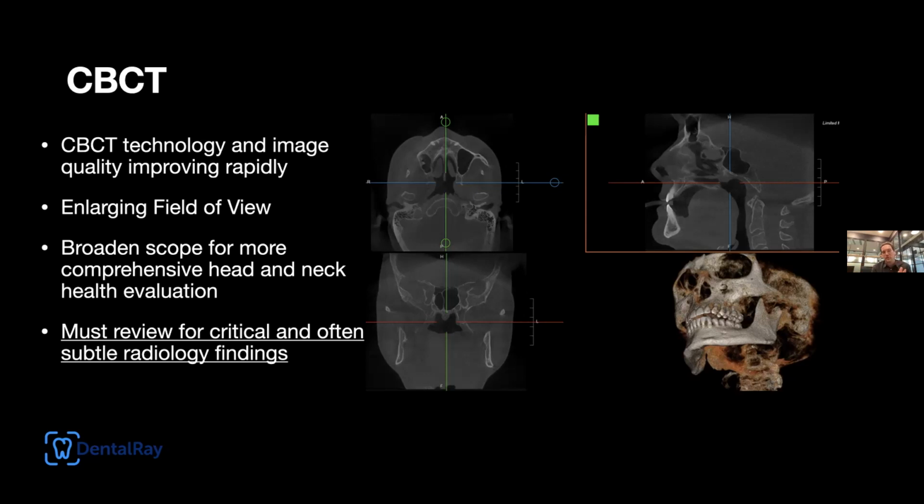And that all leads to the conclusion that it's really critical. My brother and my cousins are certainly experts in the oral cavity, and that's absolutely where their training is. My desire is to come and add an additional review, a comprehensive review of every anatomic subsite that's visualized on the scan, because there are often incidental findings, and sometimes critical findings that can be very subtle and overlooked.